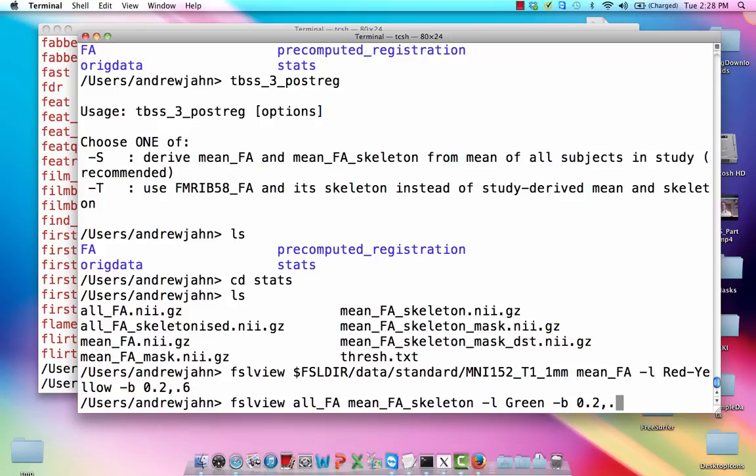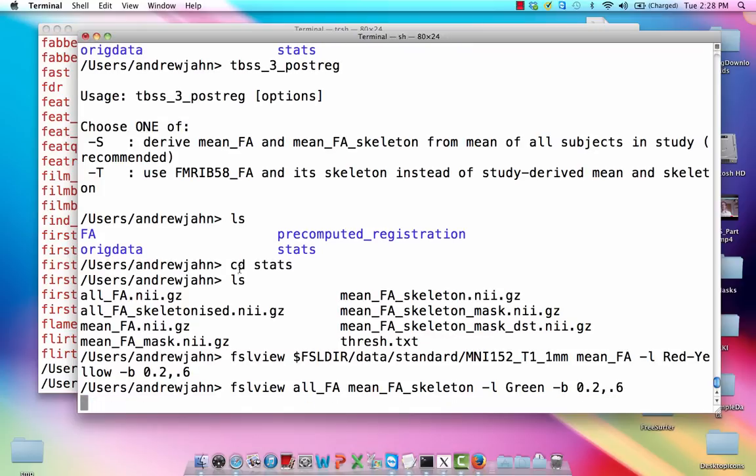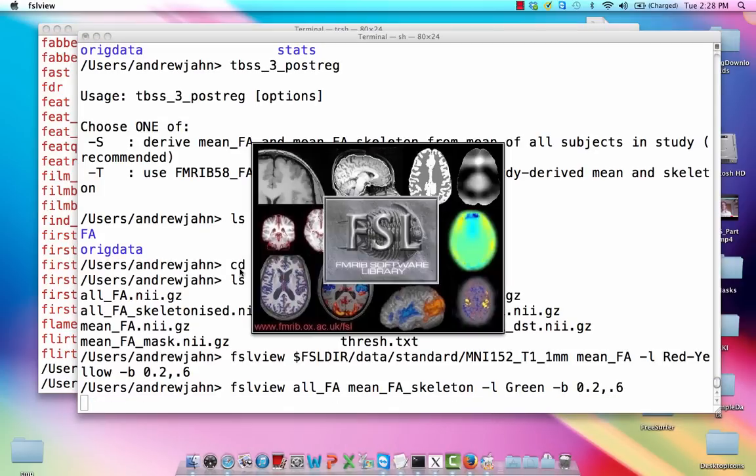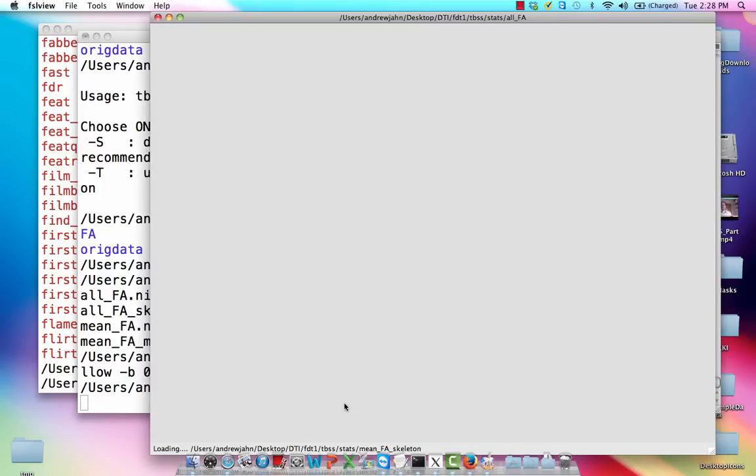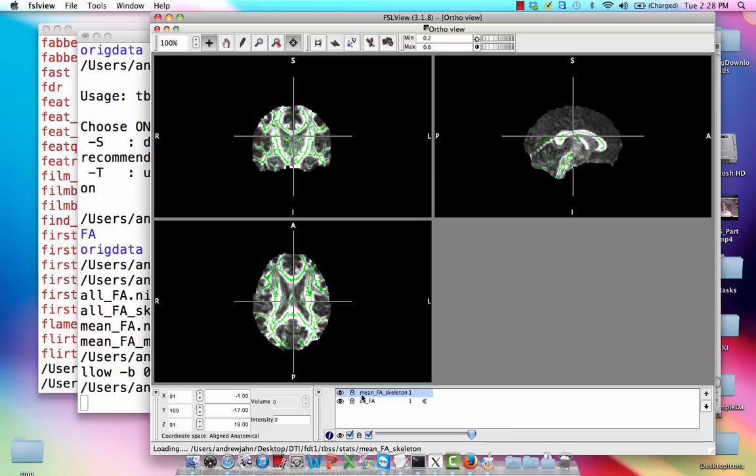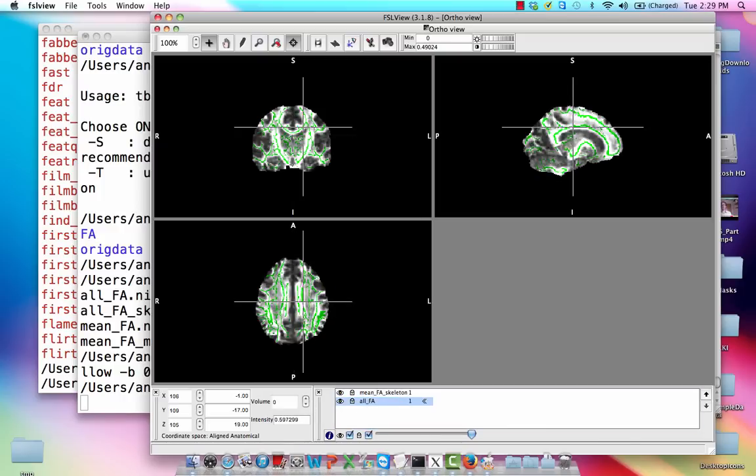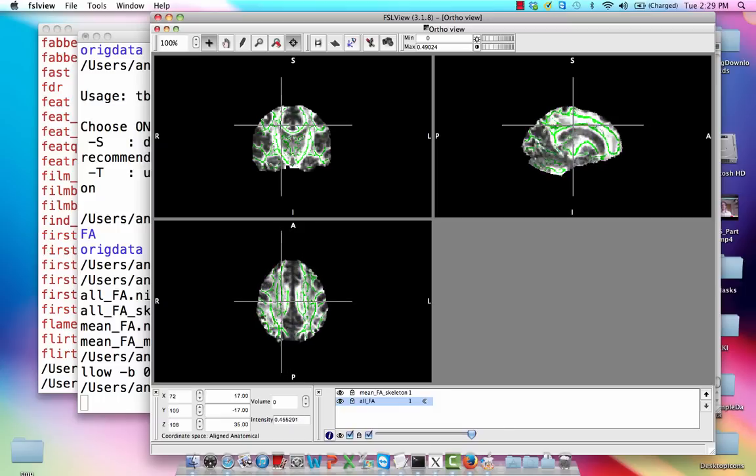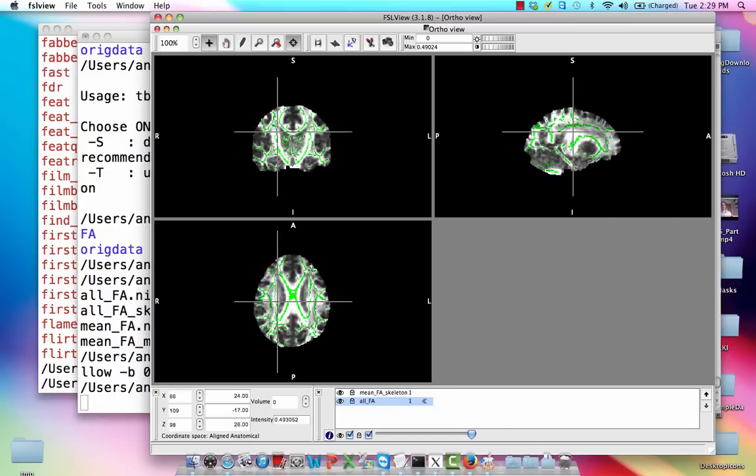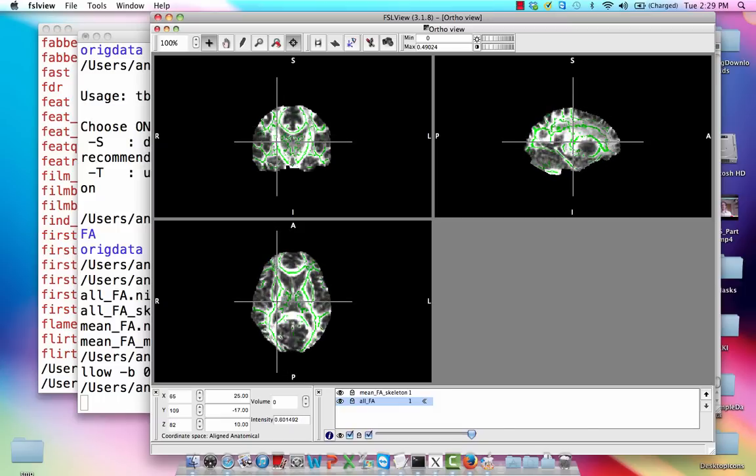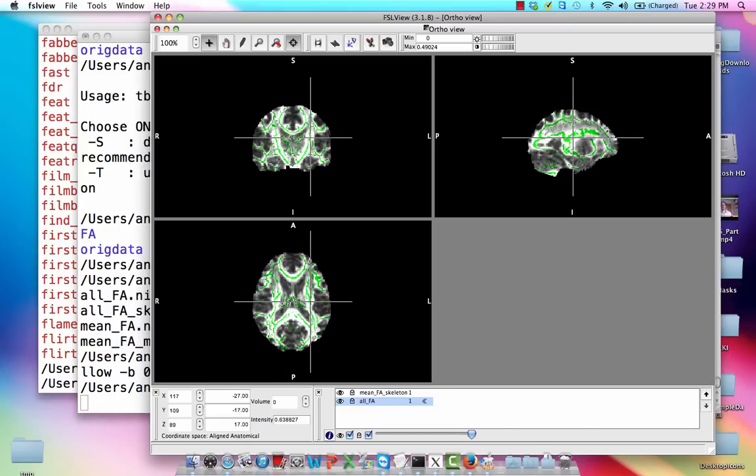And again, we're going to use a slightly different color scheme, green, and same boundaries 0.2 to 0.6. But the important thing is we'll be able to scroll through each one of these different subjects. So if I highlight all FA, notice in green this is traced out the skeleton, right?